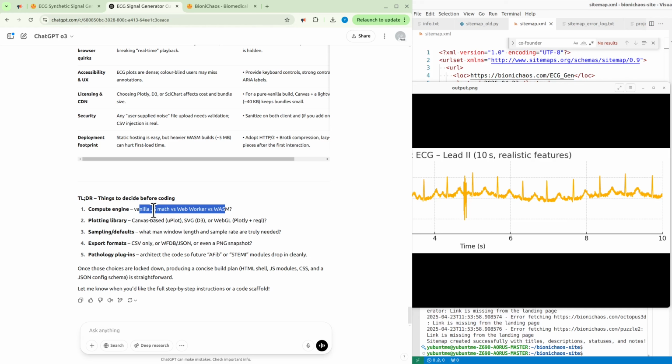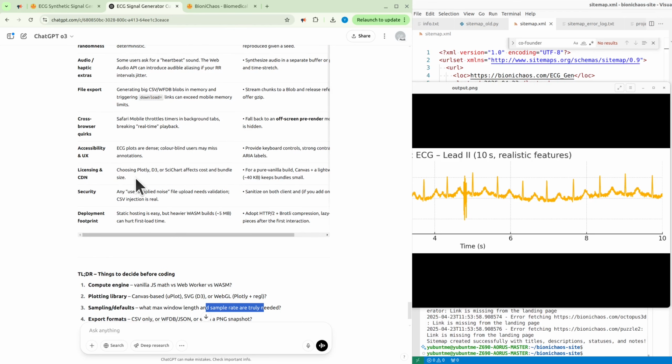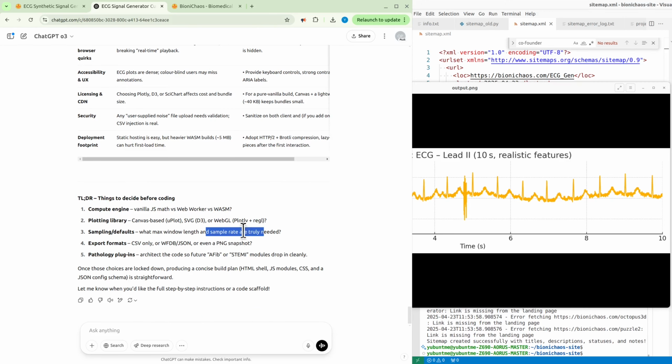Yeah, we don't mind using math.js. I don't think we need a web worker, do we? And what plotting library should we use? Any suggestions are welcome. A maximum window length, a sampling rate, are they truly needed? Well, maybe they only need it when you're exporting to file, but for visualizing stuff on the screen, not really.